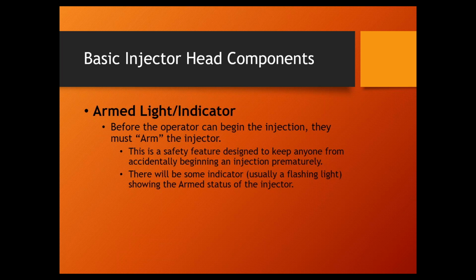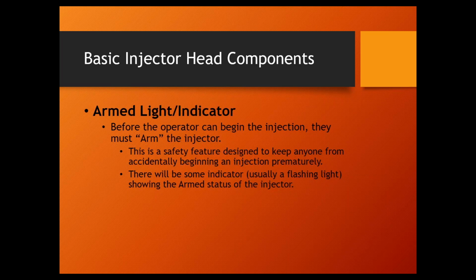Every contrast injector except the ASIST has that. Is that the last page? Yes, it was. All right. That's the gist, the very basics of every contrast injector. Anybody have any questions on anything?